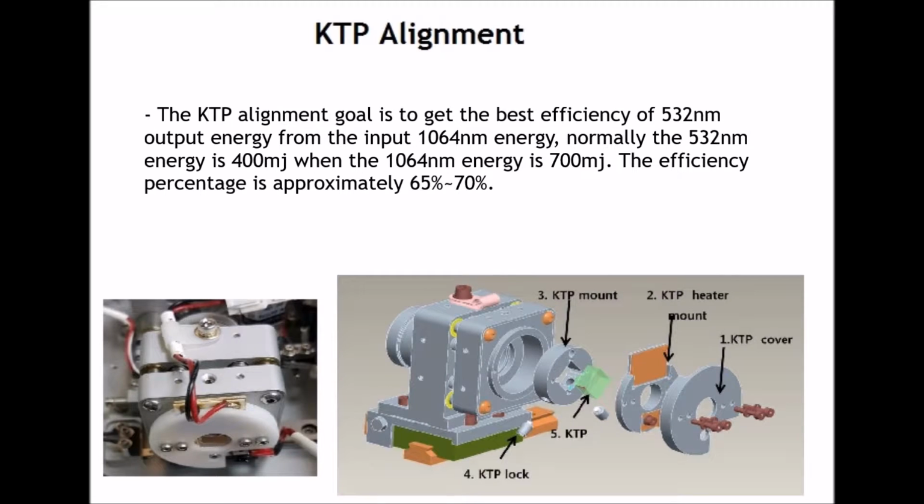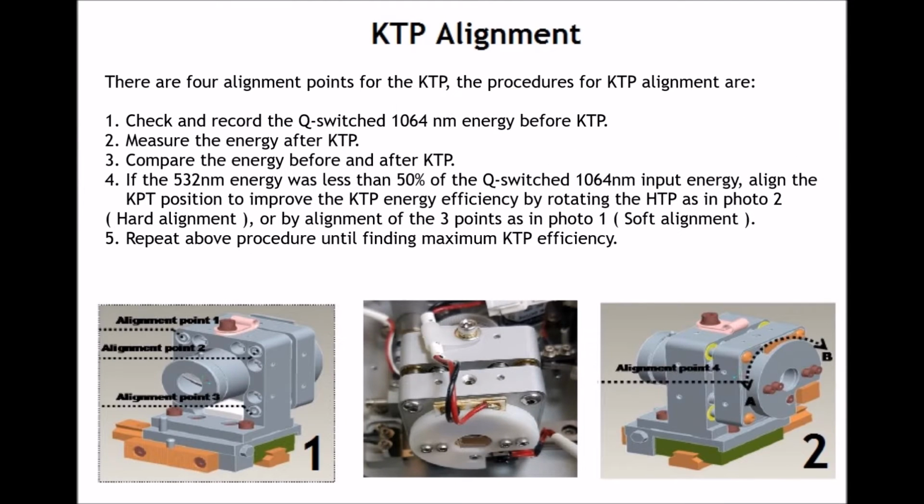KTP alignment. The KTP alignment goal is to get the best efficiency of 532 nanometer output energy from the input 1064 nanometer energy. Normally, the 532 nanometer energy is 400 millijoule when 1064 nanometer energy is 700 millijoule. The efficiency percentage is approximately 65% to 70%. There are 4 alignment points for the KTP.